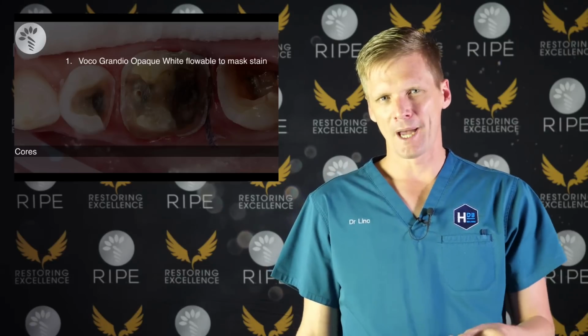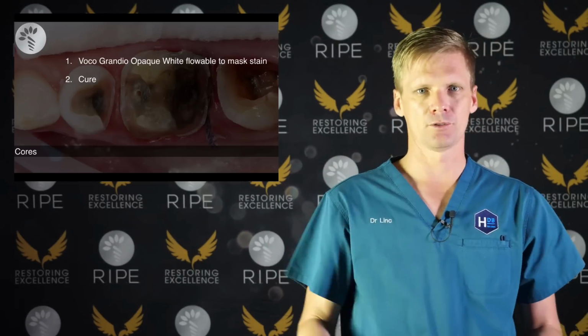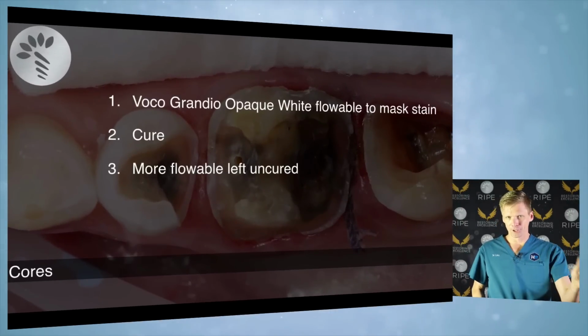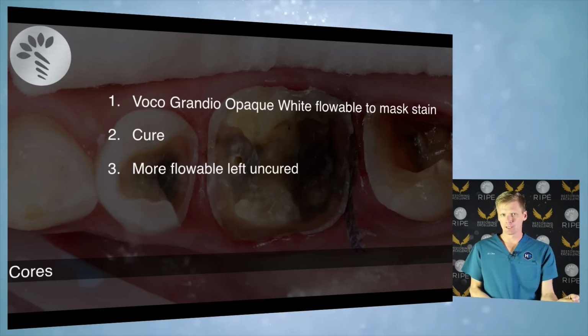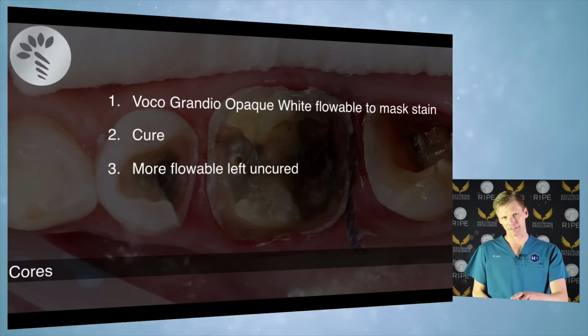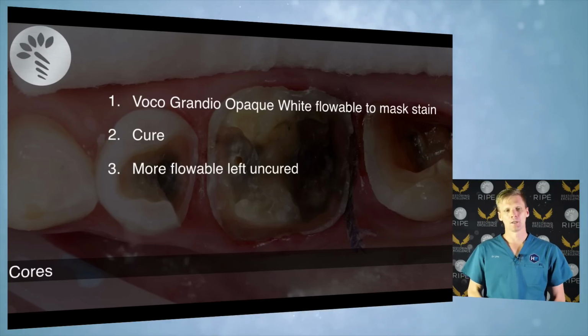You need to cure these opaque things for quite a long time, otherwise because they're opaque, the light doesn't go through and cure as easily. And after I've cured the first layer, so you want to put enough opaque white flowable on to block out the black stain. And then I'm going to put another little bit of opaque white flowable, and I'm not going to cure it. I'm going to leave it wet. Because if you don't do this step, you'll get bubbles everywhere through your core. And then your impression will look like it's got the pox, okay?